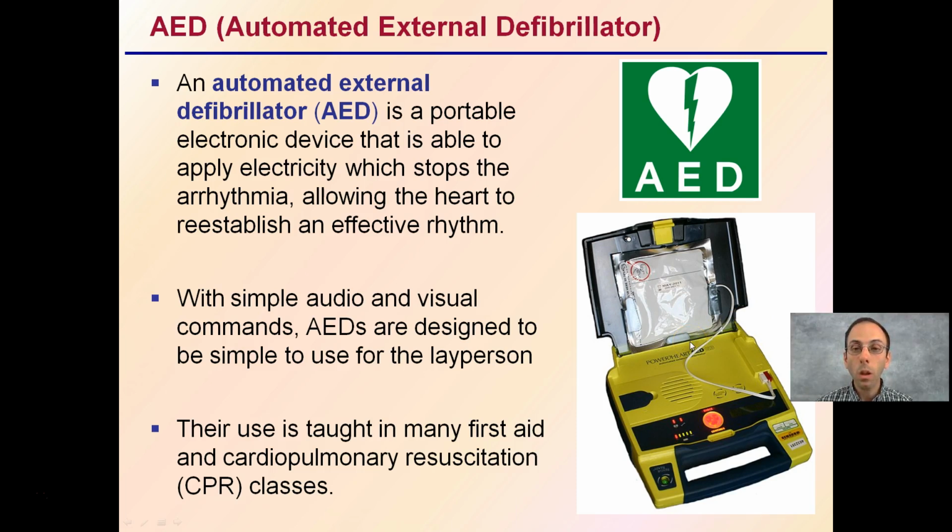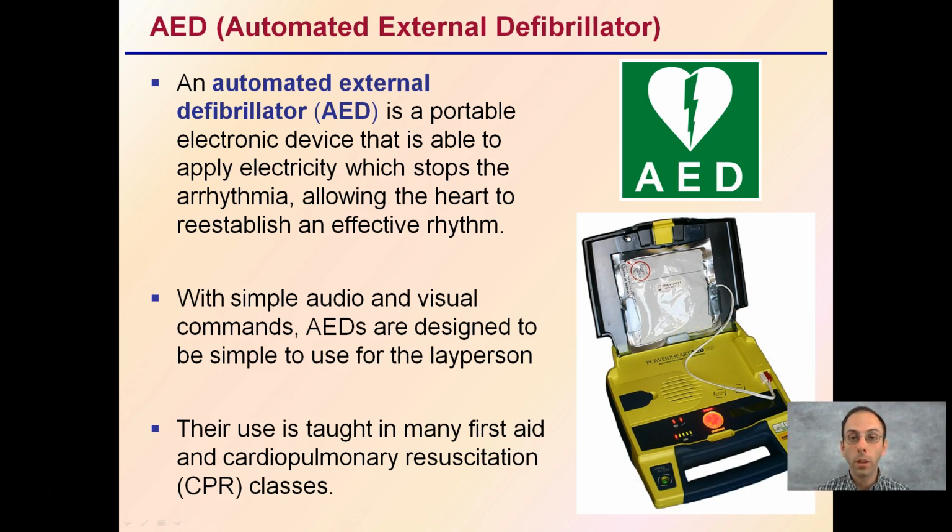Lastly, these are becoming more popular, more prevalent. We have seen this sign at airports or public areas called AED. This stands for Automated External Defibrillator. It's a portable electronic device that applies electricity, which stops the arrhythmia, allowing the heart to reestablish an effective rhythm. What's great about these is they're fully automated with simple audio and visual commands, and they're designed so basically anyone can pick them up. However, their use is being taught in many first aid and CPR classes.